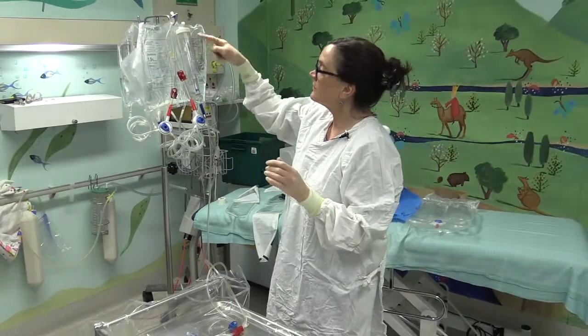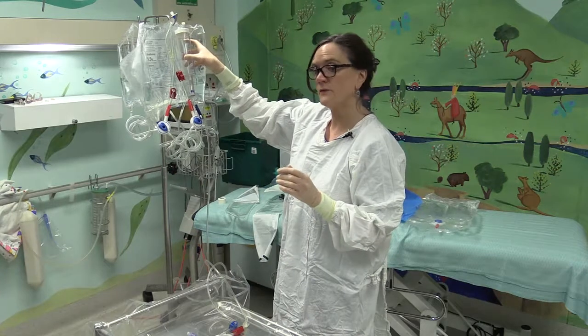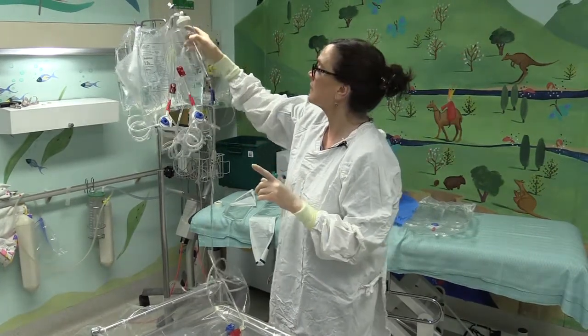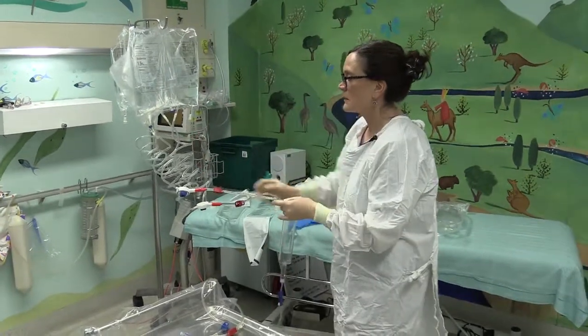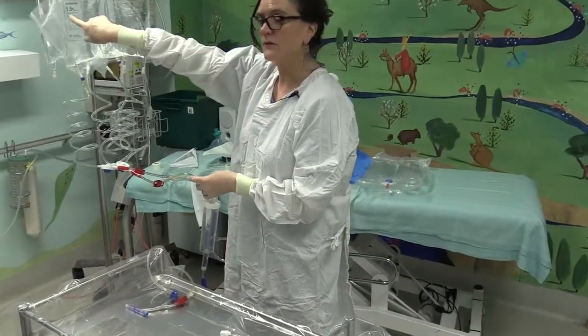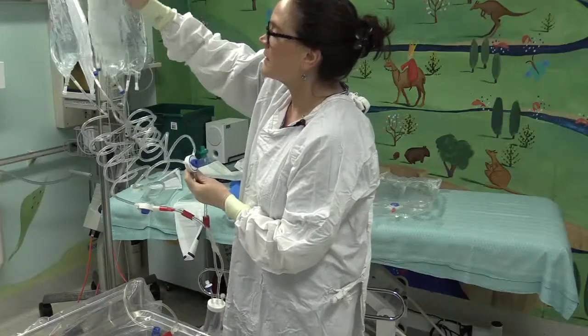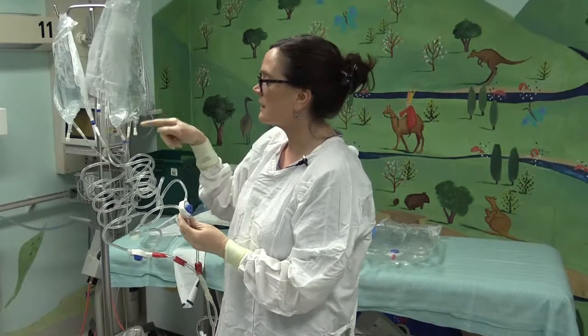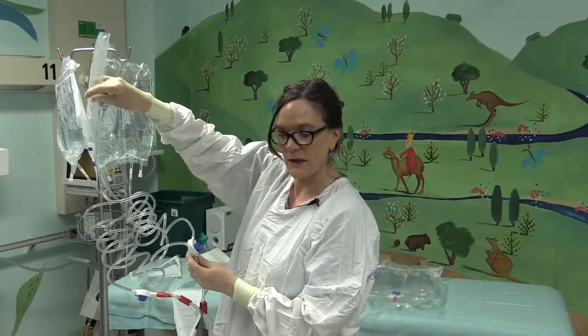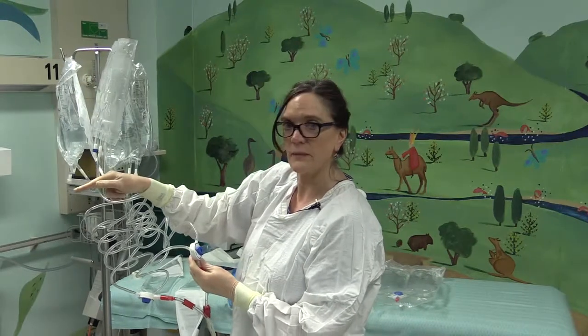I'm going to fill this cylinder, the fill cylinder, with 1.5% fluid to start with. So to do that, make sure I've got the 1.5% bag. I'm going to prime initially the air from the fluid bag into this empty bag up here, and then my assistant will clamp that bag.